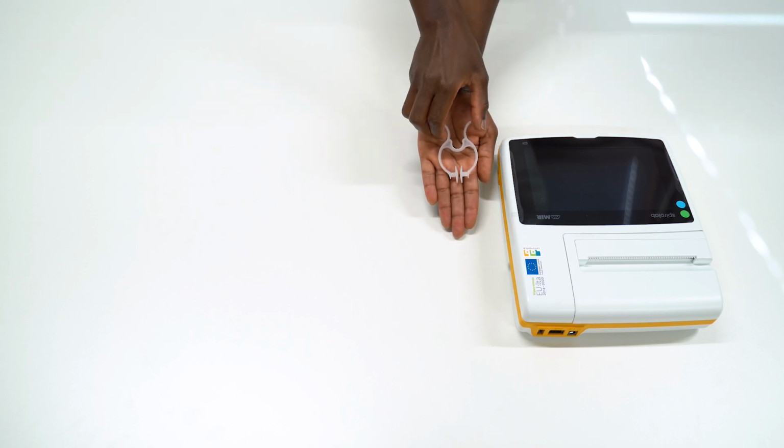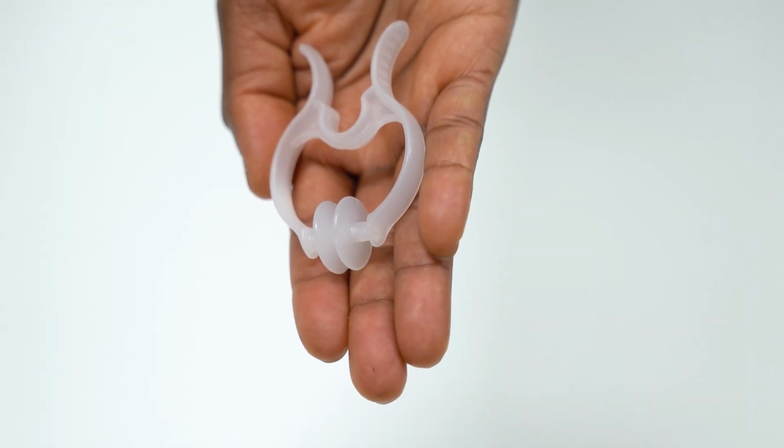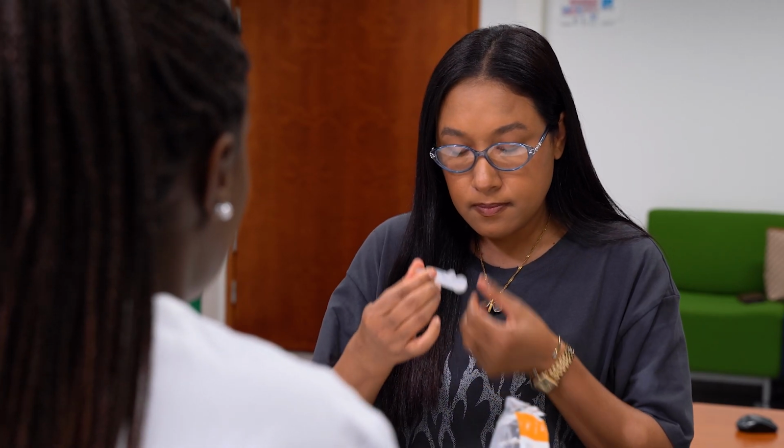This device is equipped with a rechargeable battery that can be charged using normal electrical power. It has a huge memory capacity and a high-resolution touch screen display. Nose clip. It is optional. It prevents air leakage during the test. During the test, we place a nose clip in the patient's nose to ensure they breathe only through their mouth.